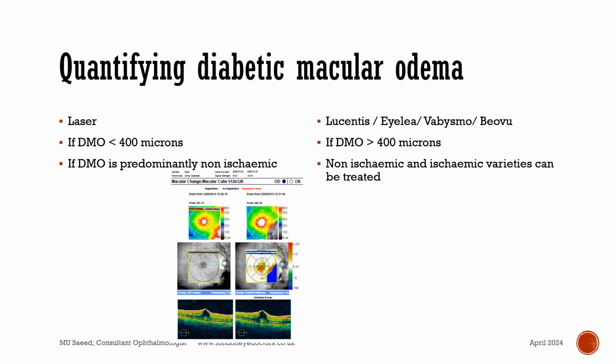But if the central fovea or the macula is not involved, then another treatment option called macular laser might also come into play, and this decision would be greatly helped with an OCT. Hence, most clinicians ask for an OCT scan.